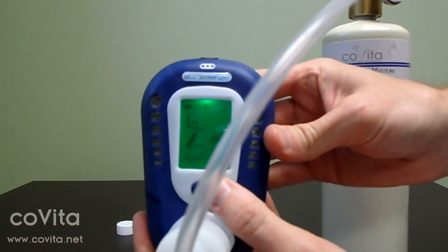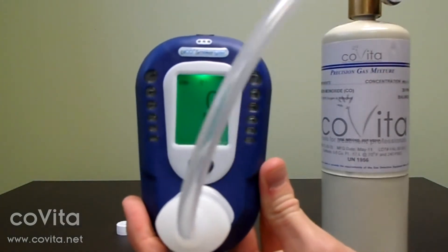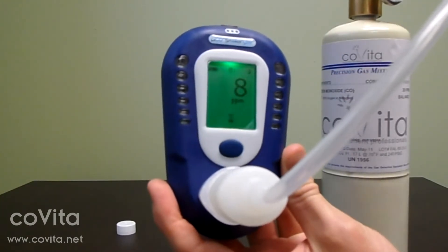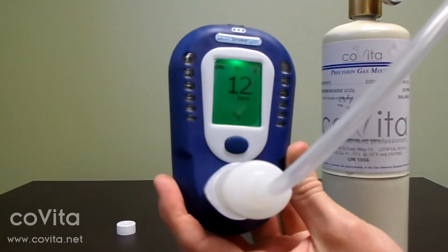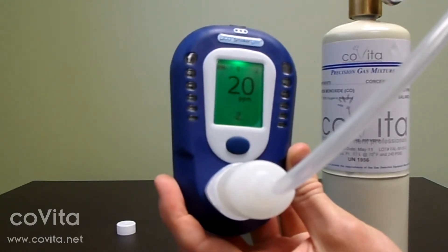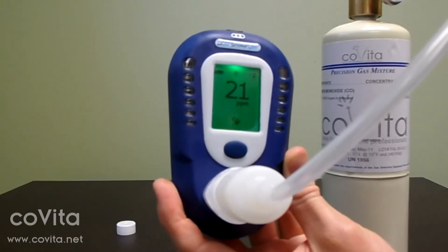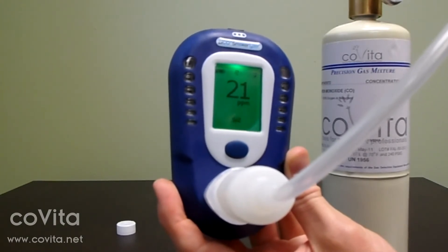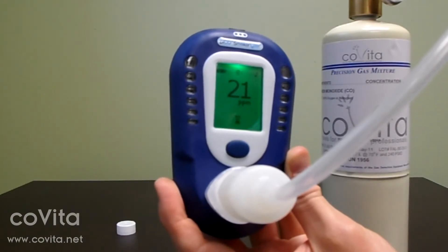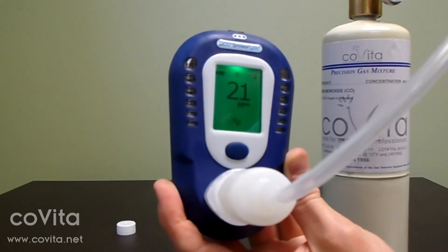Immediately turn on the flow of the gas. You may need to adjust the flow rate depending on the type of regulator you have. Some end users may find it more convenient to lay the can on its side during calibration. Allow the gas to flow and don't worry about the number you see on the screen.